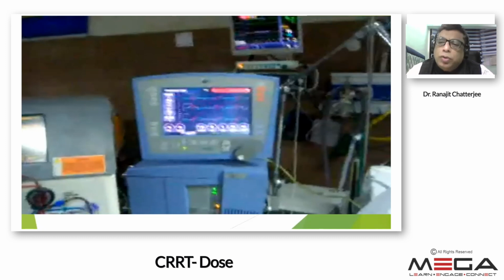It's an old machine. You don't find it nowadays in modern medical practice, because it has been taken out of the market, but it saved many patients. If you have seen properly, all four pumps are working. That means we are doing a CVVHDF here, so the effluent pump, the blood pump, every pump is working, as Dr. Vivek showed you the different pumps.